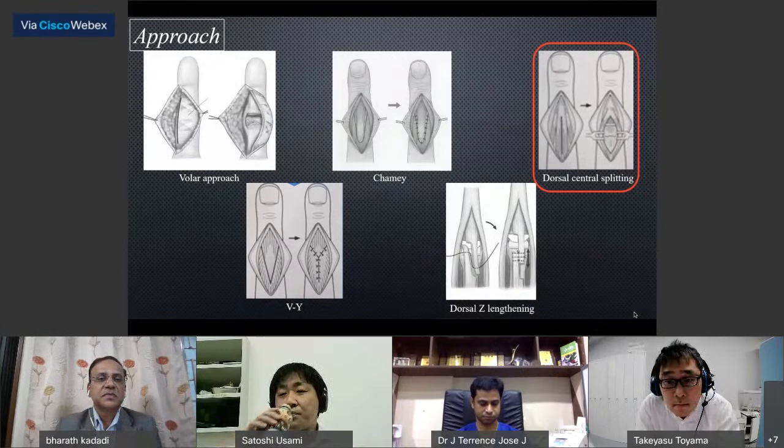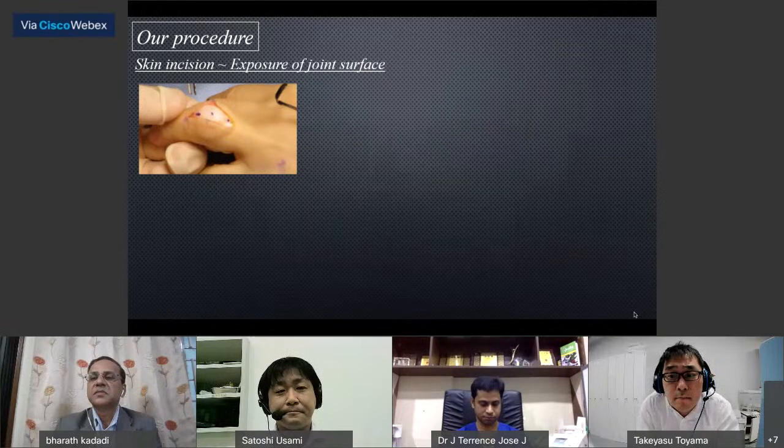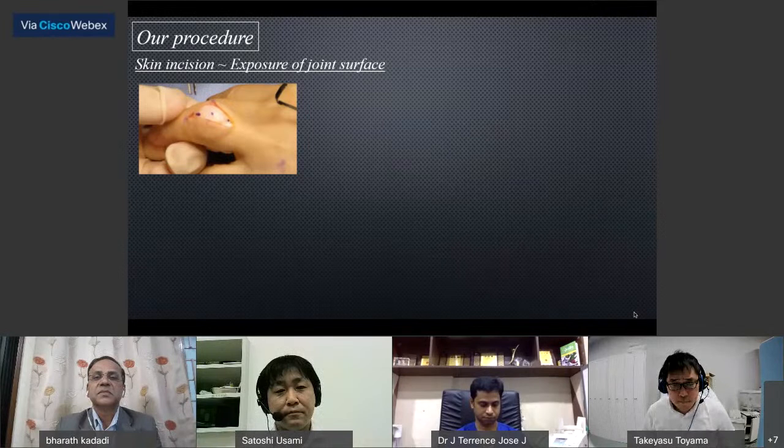This is our surgical procedure. First, a midline longitudinal incision is made on the dorsal side of the PIP to expose the extensor mechanism. A midline incision is made on the central cord to enter the joint.